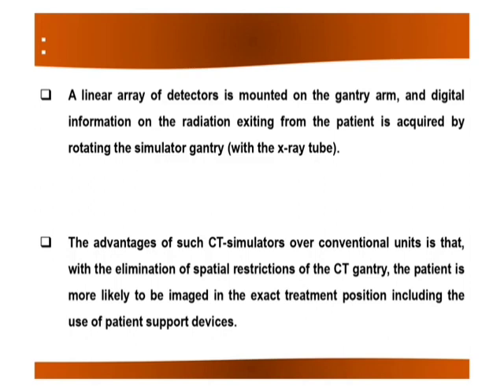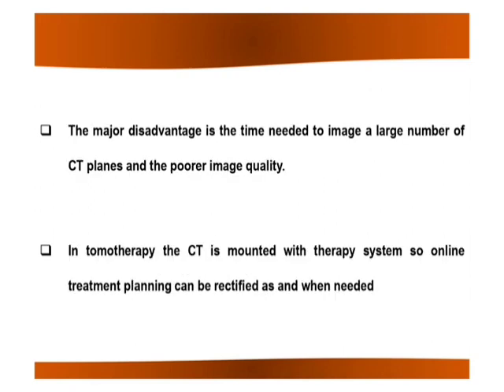So, a little bit about the electronic portal imaging devices. The EPID in radiation oncology is a recent development that may have a profound impact on the overall accuracy of radiation treatment delivery. With these devices, daily imaging of treatment localization and verification become possible as well as feasible. Along with image acquisition, analysis, storage, and distribution of portal images can be performed very easily.